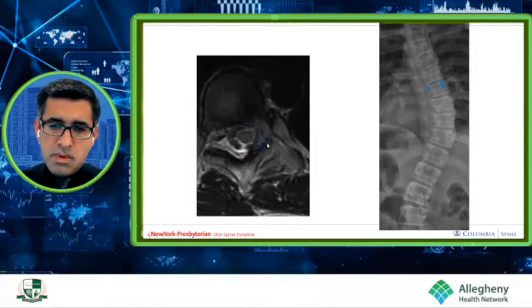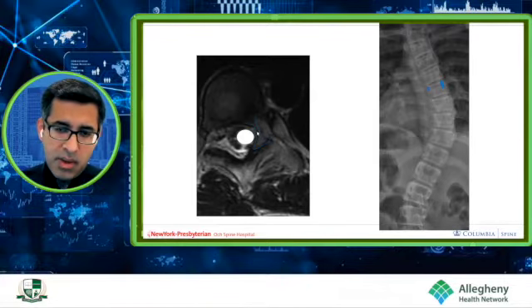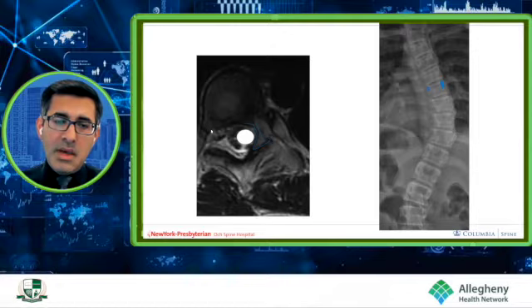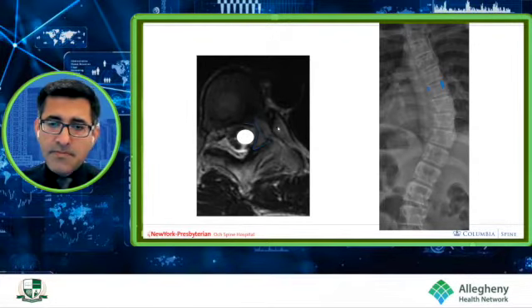So it's important to know these variations. You can also see the spinal cord here is quite close to this small concave pedicle. So it does put the spinal cord at a higher risk as opposed to the pedicle on the other side, which we don't have here. But that other pedicle on the convexity is quite far away from the thoracic spinal cord and makes it a safer pedicle.